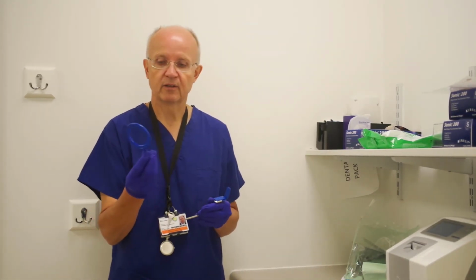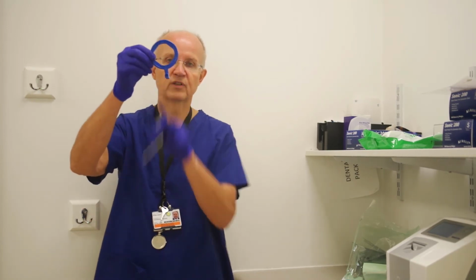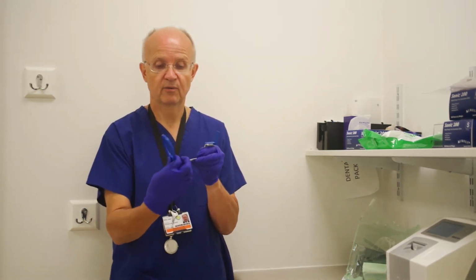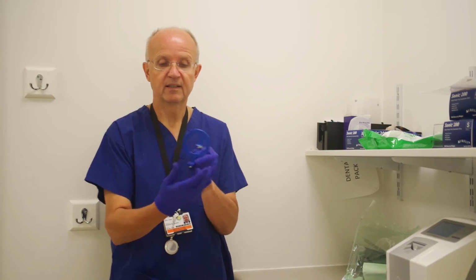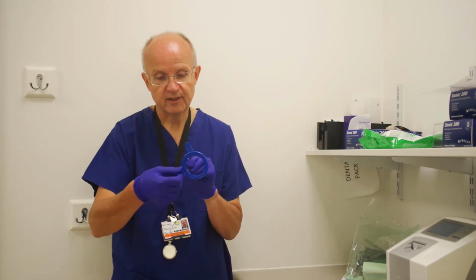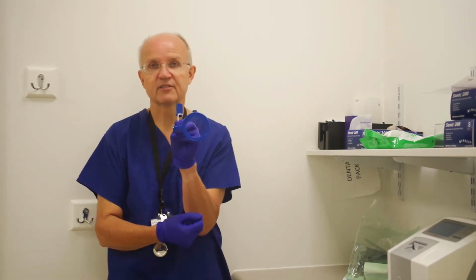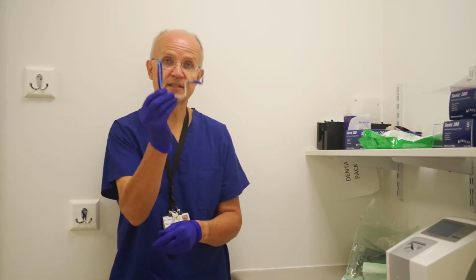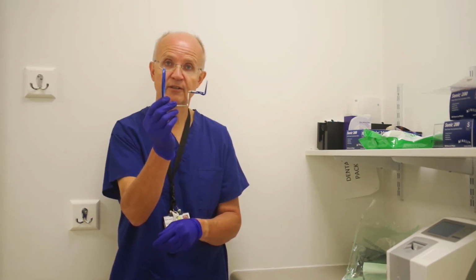With the anterior one, you can see that the bar comes straight out of the bottom. So actually it doesn't matter whether I put it on that way or that way, it's still going to be right in the centre. Clearly, what you don't want to do is put it that way, because that's completely wrong. So just get that nicely set up, and that's how you set up your anterior holder.